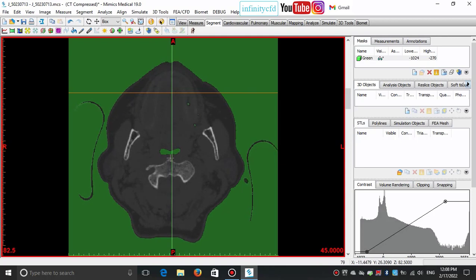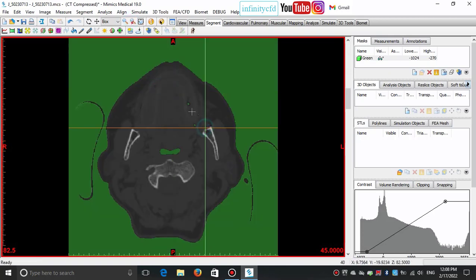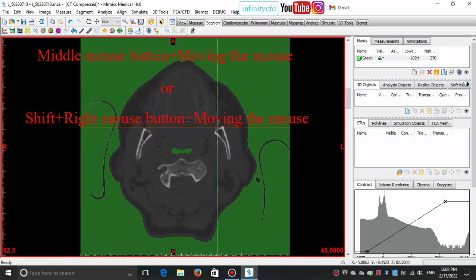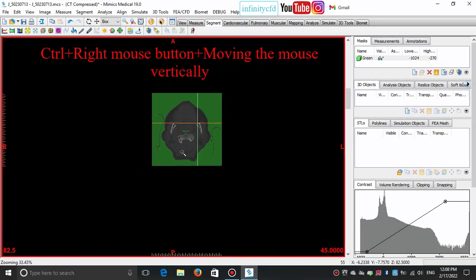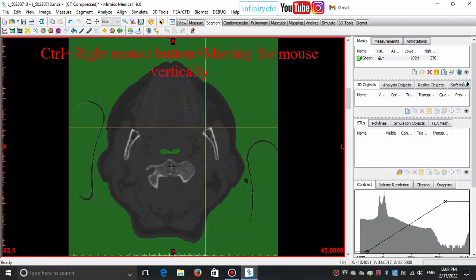We need to perform some operations to modify our mask. For getting a better view, we can zoom in to a region or zoom out. We can pan by pressing the middle mouse button or Shift plus right mouse button and moving the mouse wherever we want, as well as zoom in by holding Ctrl plus right mouse button and moving the mouse vertically.